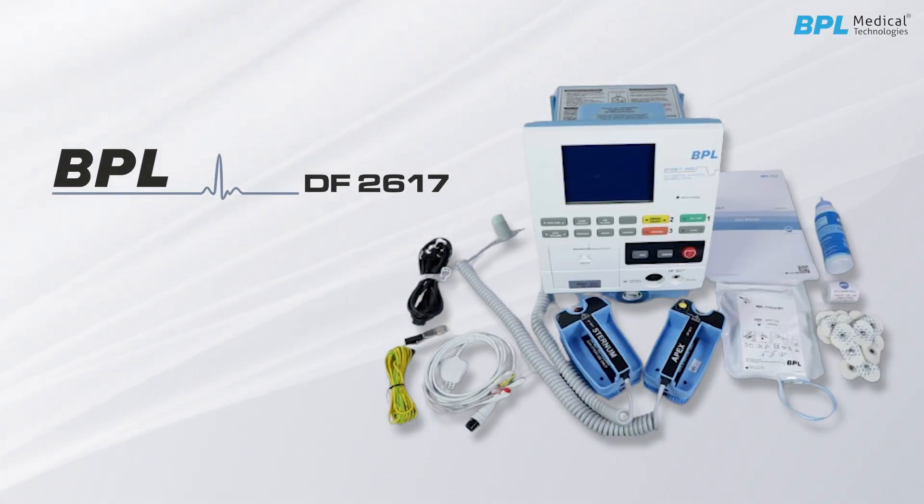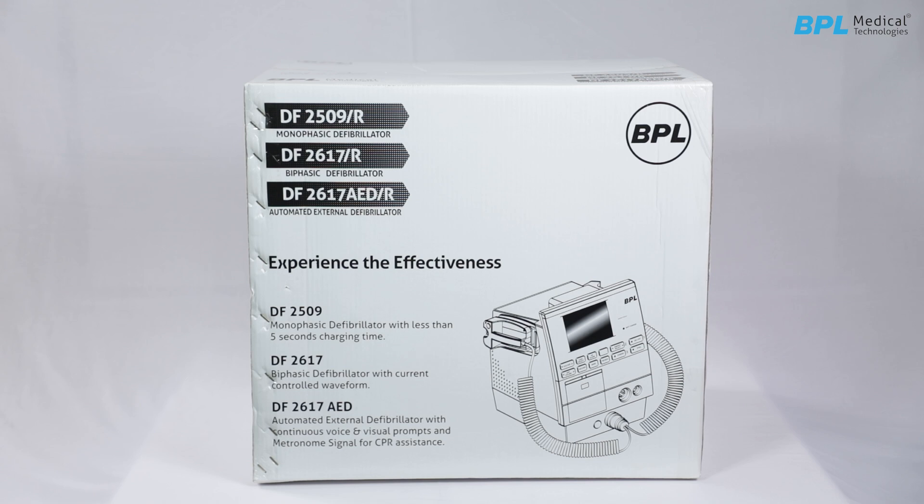Introducing the BPL-DF 2617. Welcome to the guide for unpacking and operating the BPL-DF 2617.